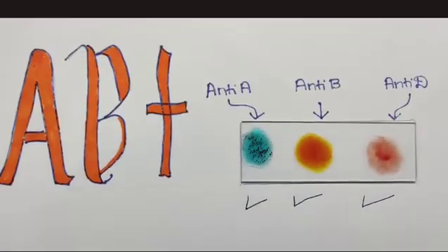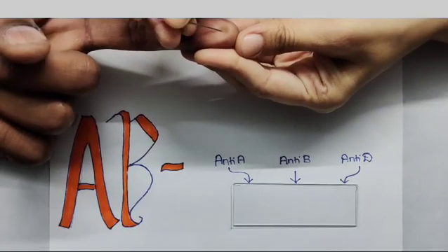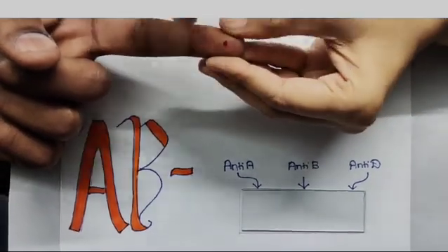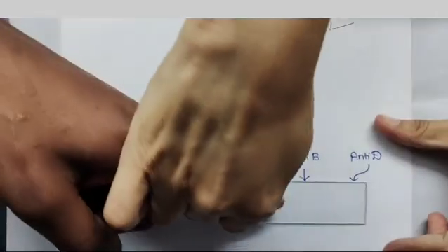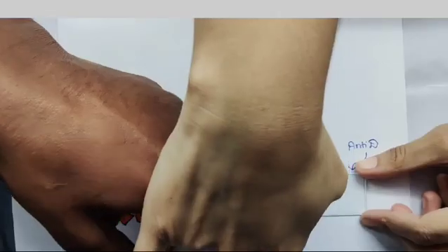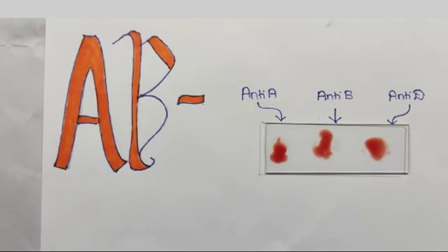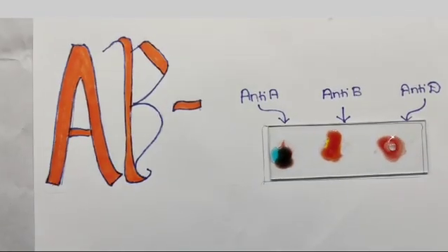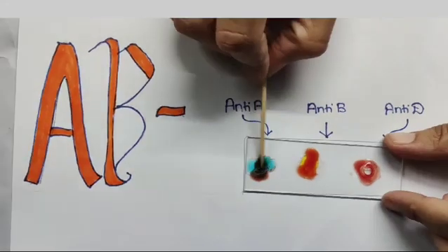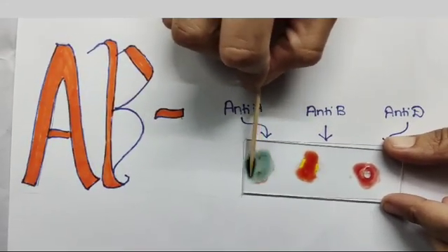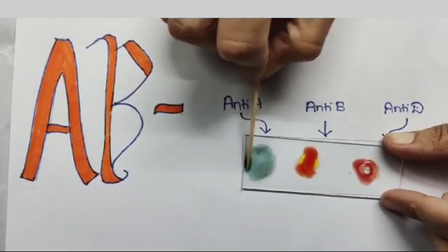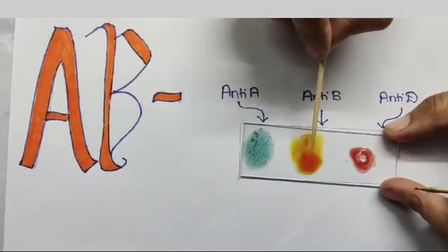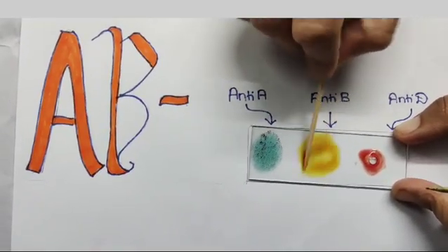Repeat the same for AB negative blood group. Here, clotting will be seen in both anti-A and anti-B, which means both antigen A and antigen B are present. It is AB blood group. No clotting is seen in anti-D, which means Rh antigen is absent.